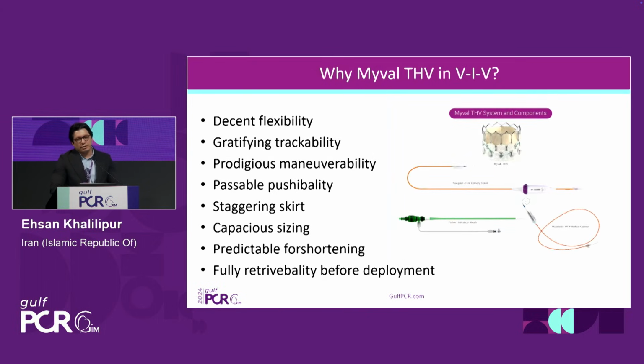Why have we chosen the Myval for this procedure? Because it has decent flexibility, gratifying trackability, prodigious maneuverability, passable pushability, staggering skirt, capacious sizing. We know that there is no need to add or less CC for this valve, predictable foreshortening, and full retrievability before deployment.